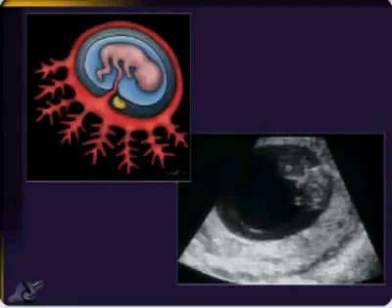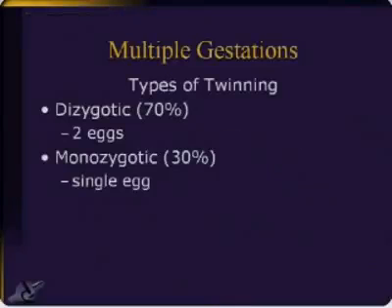Because if you stick a needle through here and rip up a little flap of amnion, the back side of that thing is like flypaper. It can just glom on to a fetal extremity, and this is one of the ways that you can get amniotic band syndrome, and it's why we don't do amniocentesis.